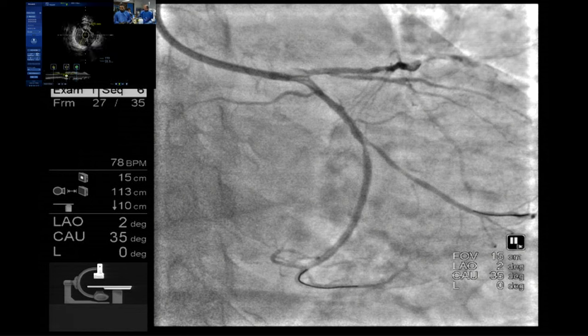Okay, good. So the stent is a 2.5 times 24, and I want an NC balloon. It's a 3.5 times 8 NC balloon for first crush. So DK crush is a double kissing and double crush. So Tak, for crushing, do you always use a short balloon? Yes.